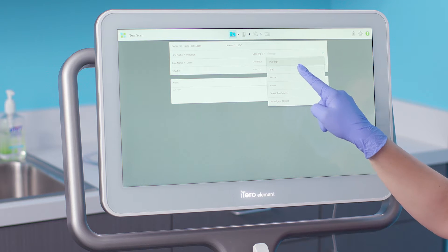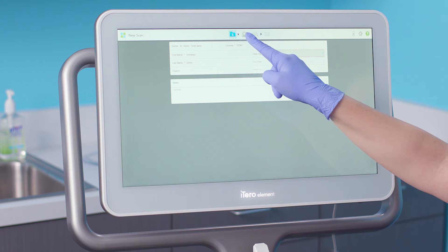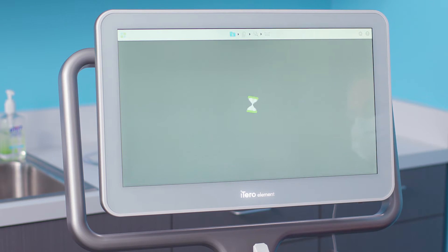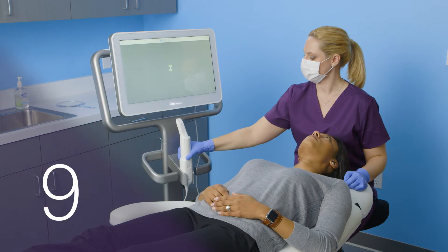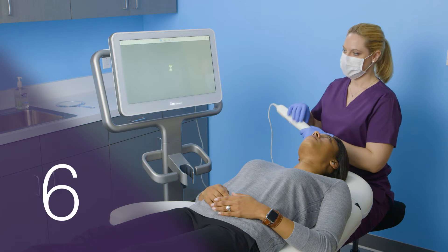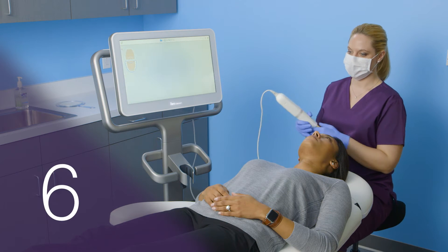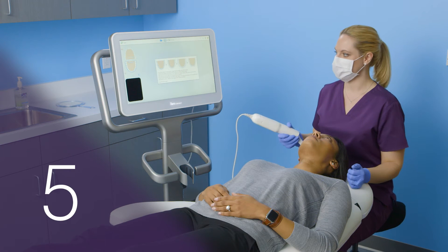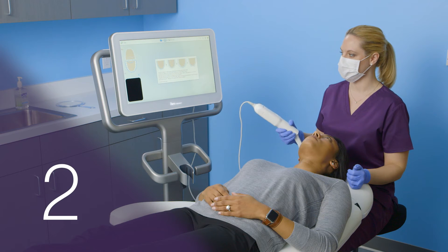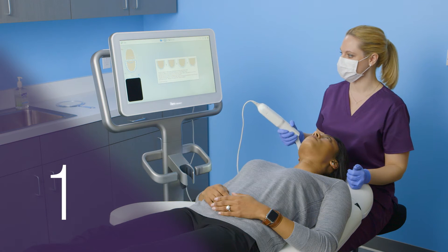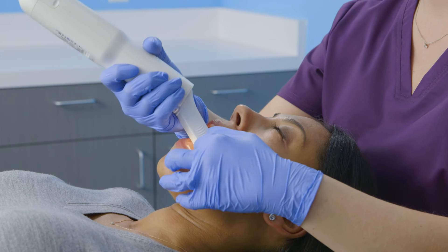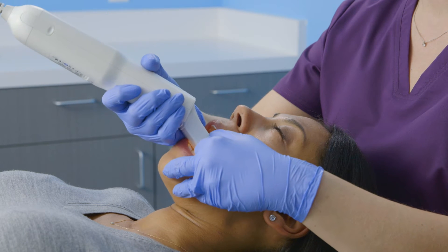I'll tap on the scanning sleeve icon at the top of the screen to activate the wand. Waiting 10 seconds after the light turns on allows the tip to defog before I place it in the patient's mouth. Next, I will place the tip of the wand on the occlusal surface of the terminal molar.